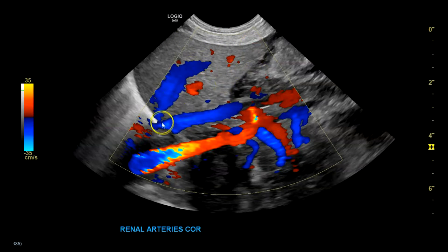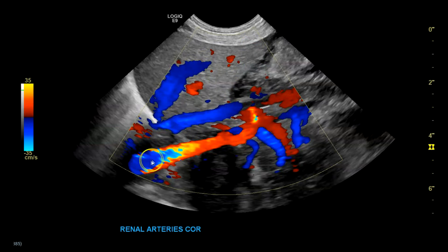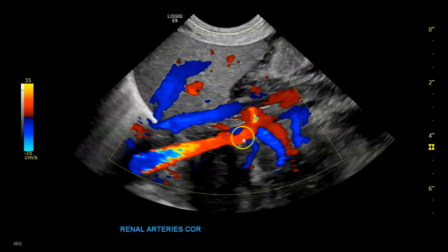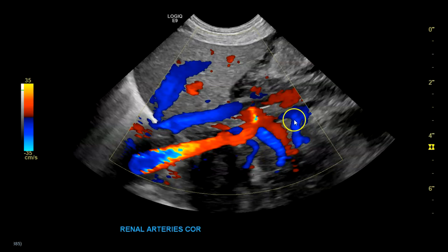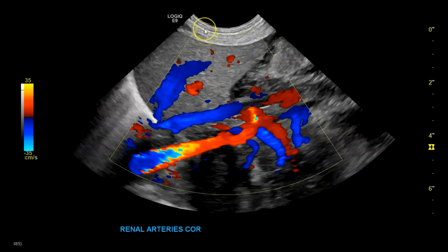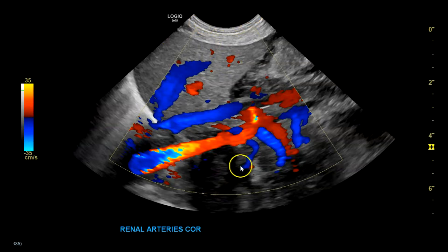You see some aliasing here. In order to fix that, you can go up on scale, and then you can see the one, two, and three renal vessels — the renal arteries. Now these vessels are going away from the transducer.